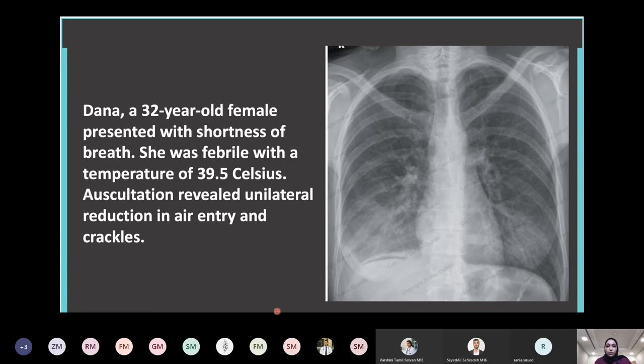It's actually the lower base of the right lung, because it has more opacity, and usually you'd hear that at the bottom. The upper lobe is very, yeah, right lung, absolutely, Sara. The lungs here look fine. They look black, nice. You can see there's air entry, etc.